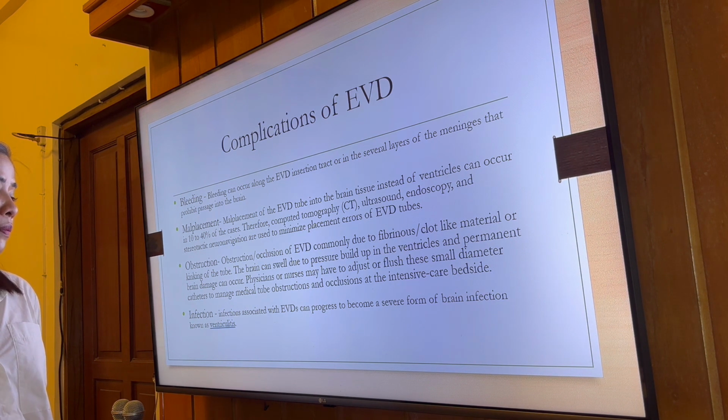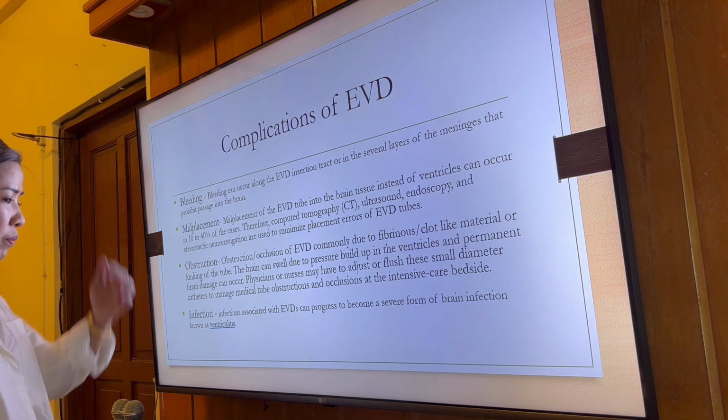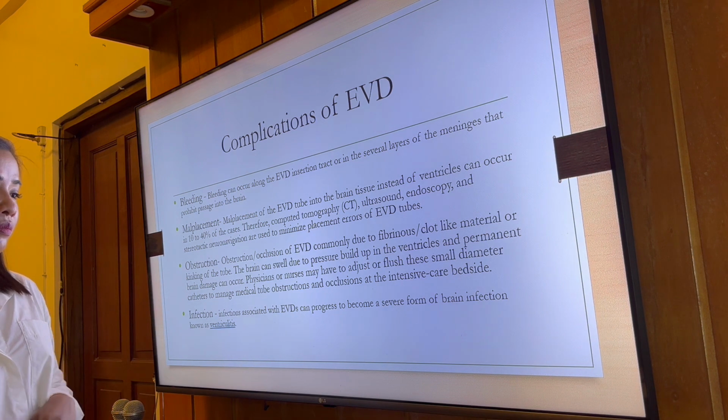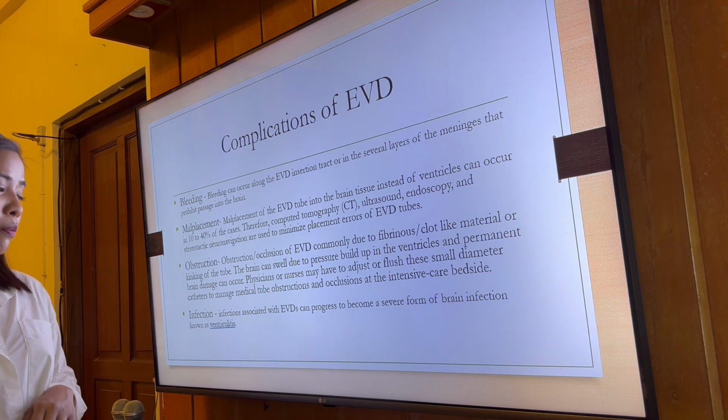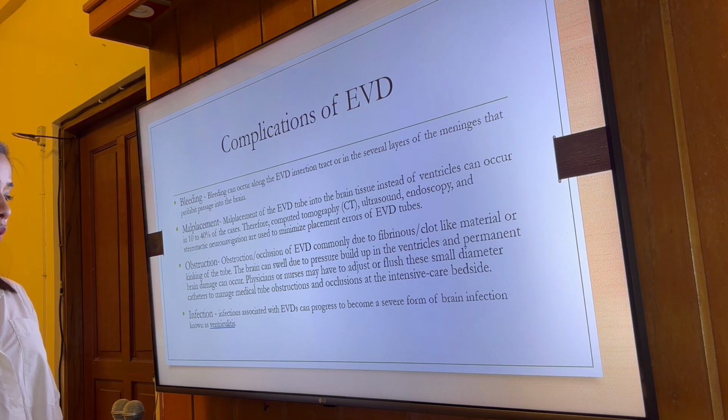Infection can also occur associated with EVDs, and we need to prevent it from becoming a severe form of brain infection known as ventriculitis.